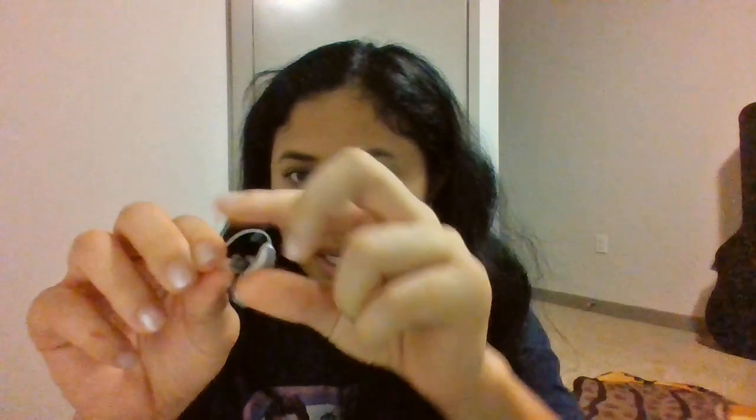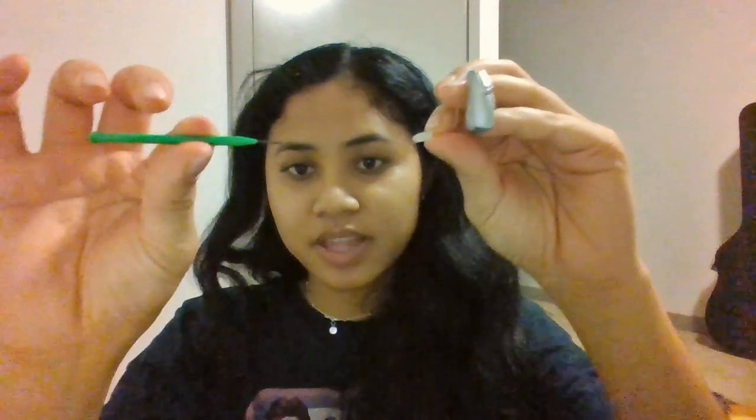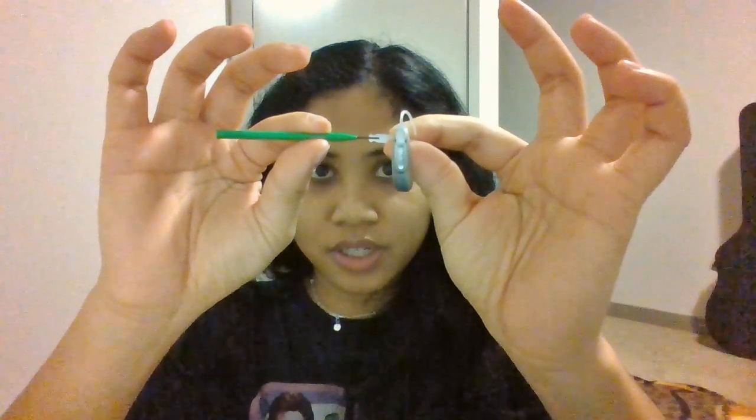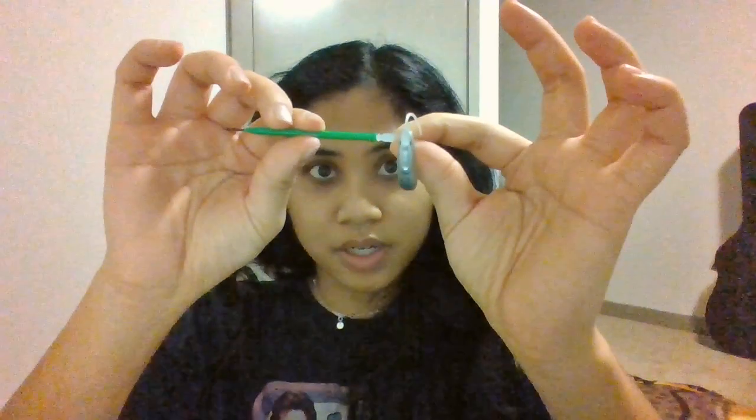When you get a new receiver, make sure you also put back a new dome. It's also good practice to change your domes every now and then, as those collect earwax. Behind that, your receiver will have a wax trap that also collects earwax. To replace it, take the earwax trap replacer — one side has a prongy end and the other has a brand new earwax trap. Stick the prong into your used earwax trap and it should slide off when you pull apart. Then flip it over and replace it with a new wax trap.